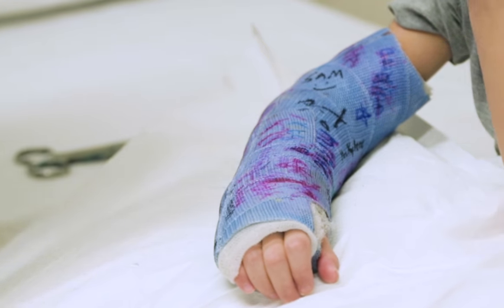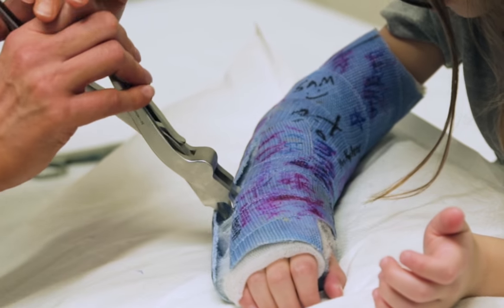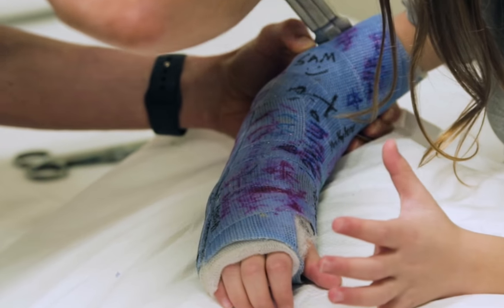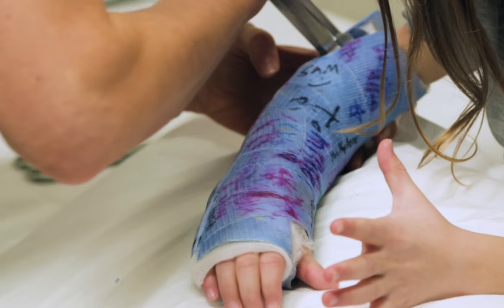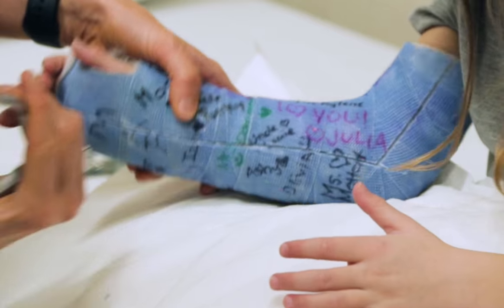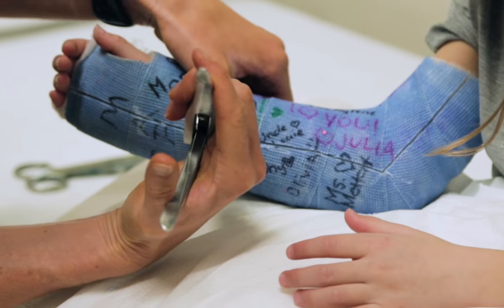So now we're going to pry it apart. And then the other side. Flip. This is cool. That's what it looks like inside. Good job.